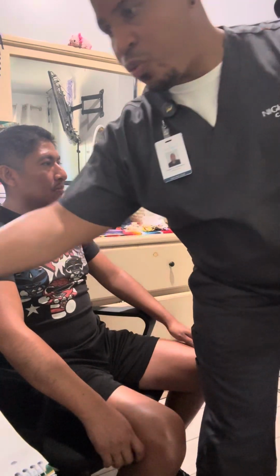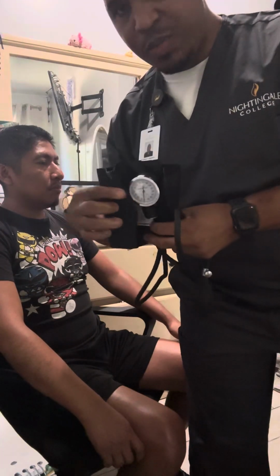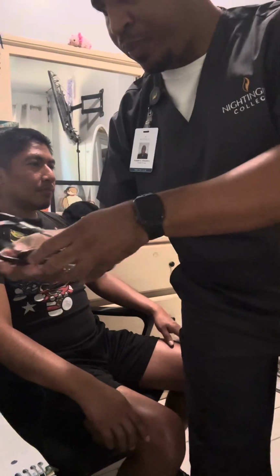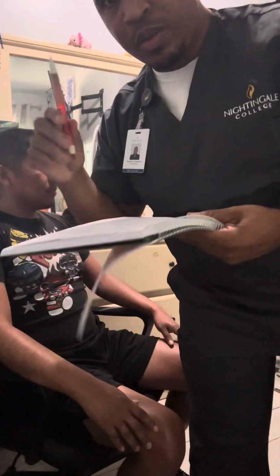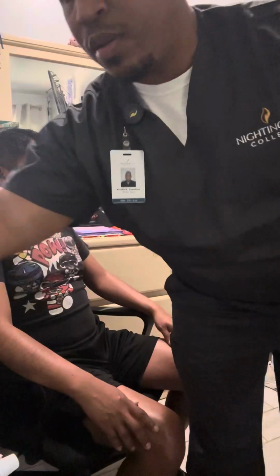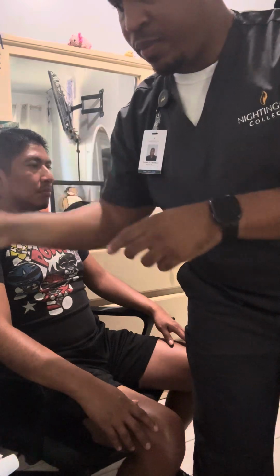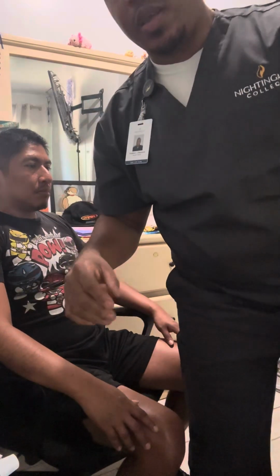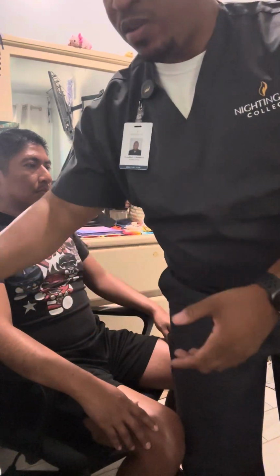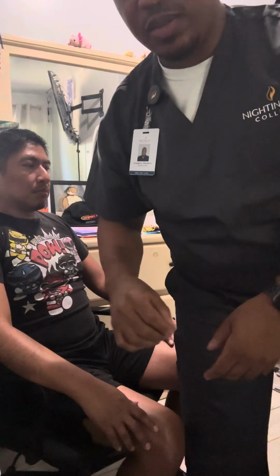Right here I have my blood pressure cuff with my sphygmomanometer, my stethoscope, pen and paper so I can document my findings. I have hand sanitizer for hand washing. And also I have alcohol wipes, which I will clean the stethoscope with for sanitation.